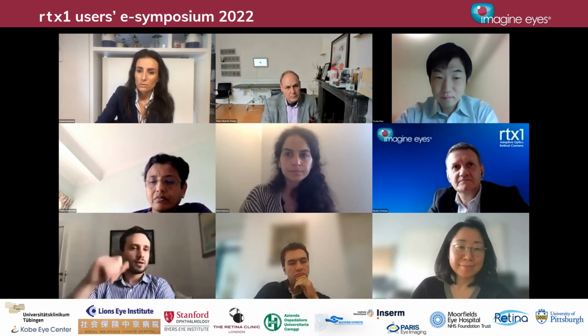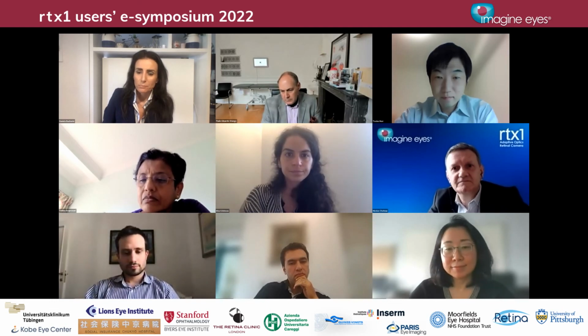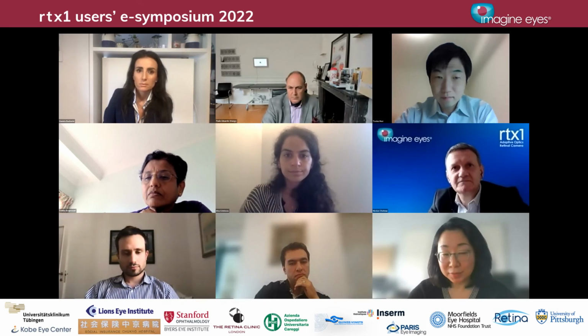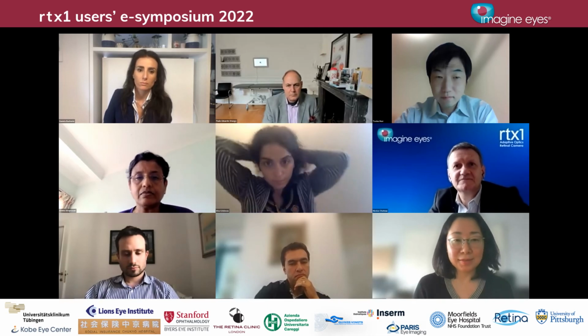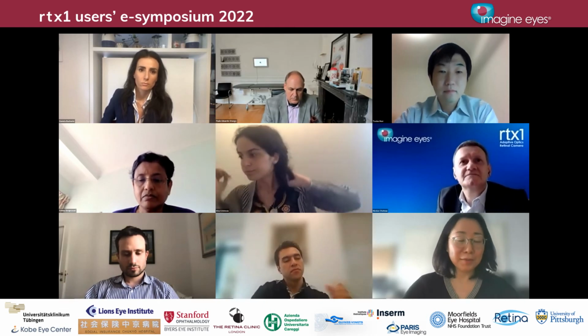We have a question from the audience, and the question is, can you see ganglion cells with the Merlin? For the ganglion cells, we haven't seen them because it's not high contrast enough with the Merlin system, because it doesn't include the other optic system. So I haven't seen it yet.